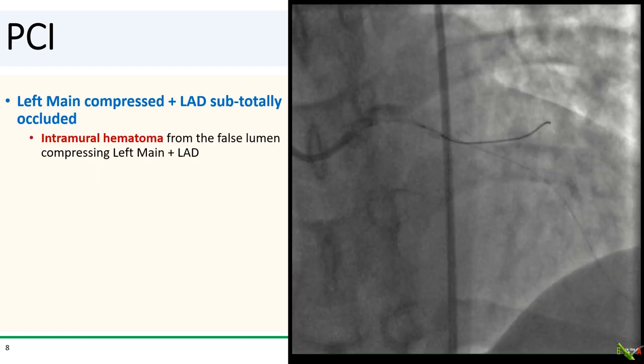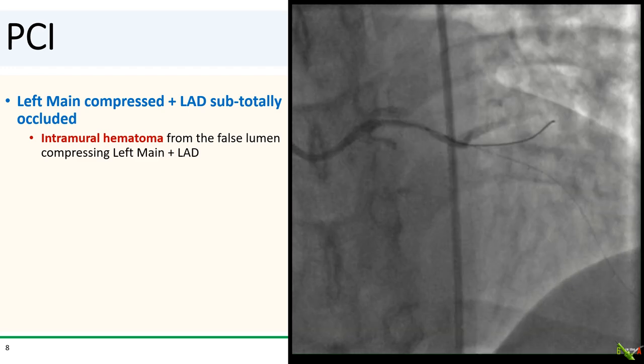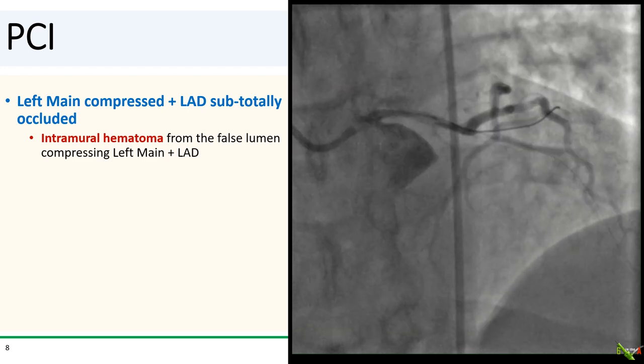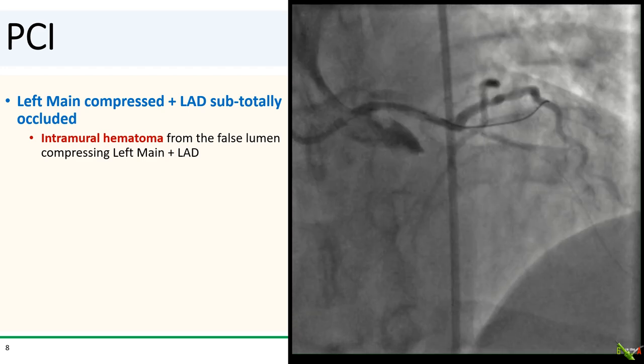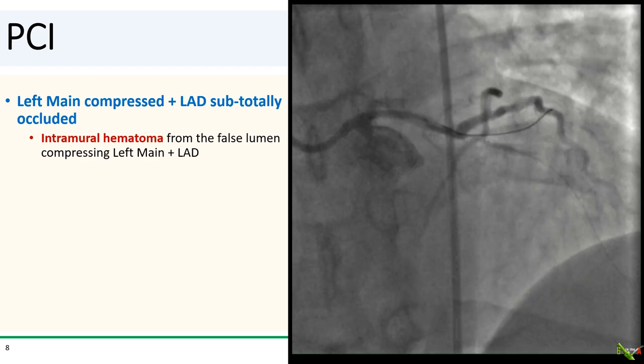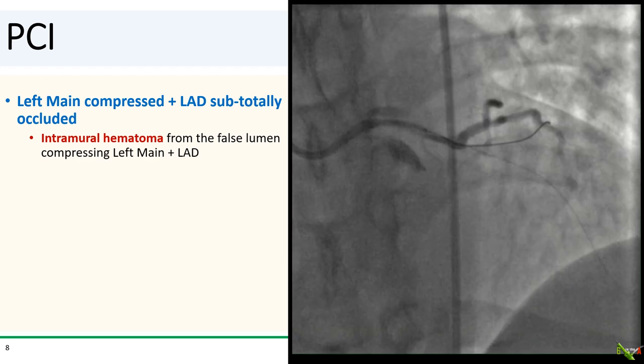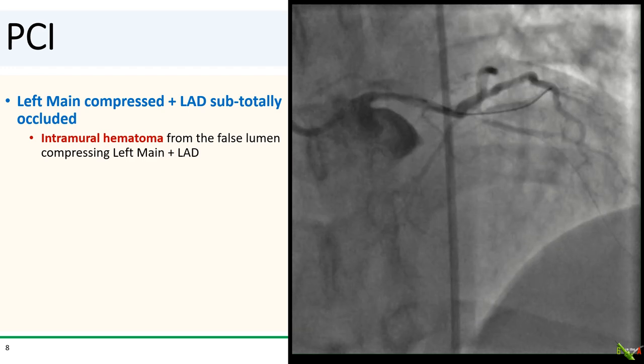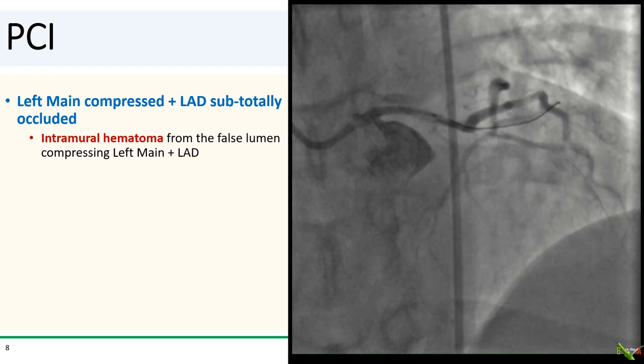Once a wire was down across the left main and in the ramus, a more selective shot was taken. You can see here that the left main is clearly compressed, with the false lumen pressing down into the true lumen. The LAD is subtotally occluded, again from compression from the propagating intramural hematoma.